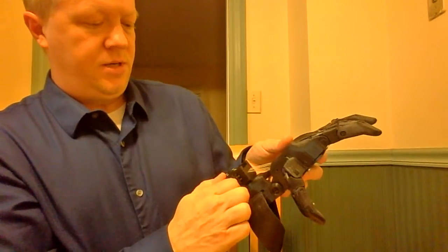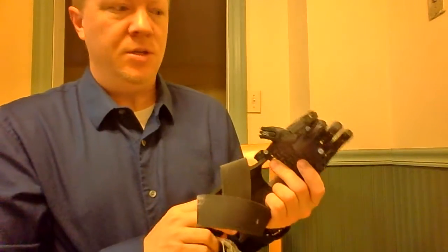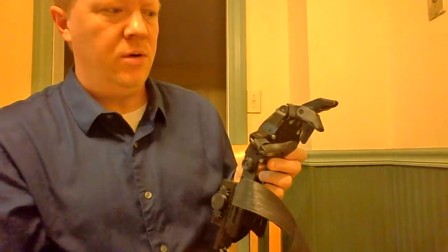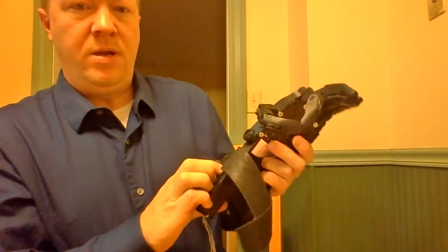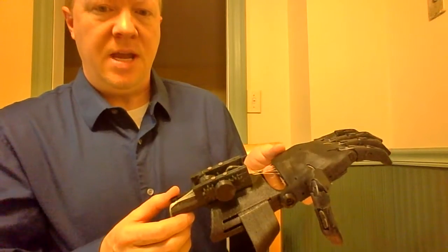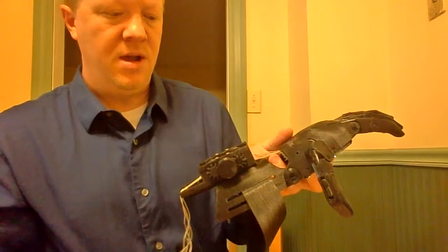At the next position, this is where I get the three-finger grip, which was supposed to be designed for holding either a spoon or a pencil or whatever. And then the last position right here gives me the two-finger pinch. So I get the same overall output with something half as height.